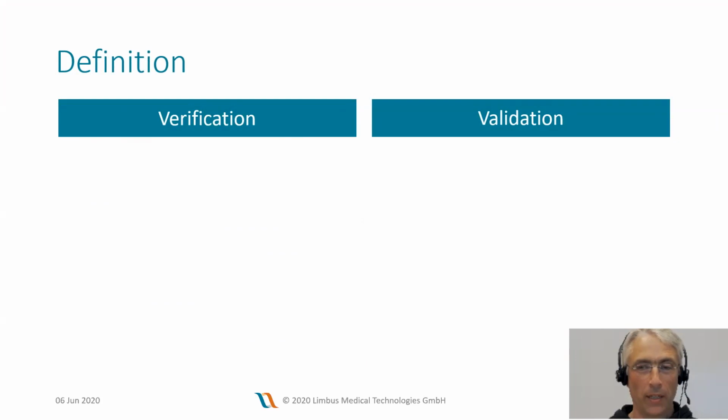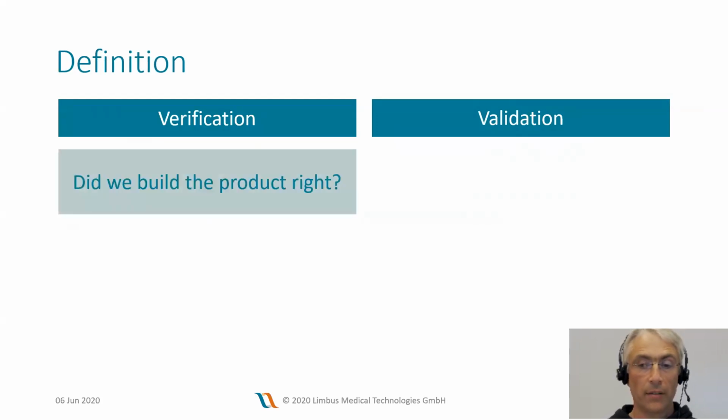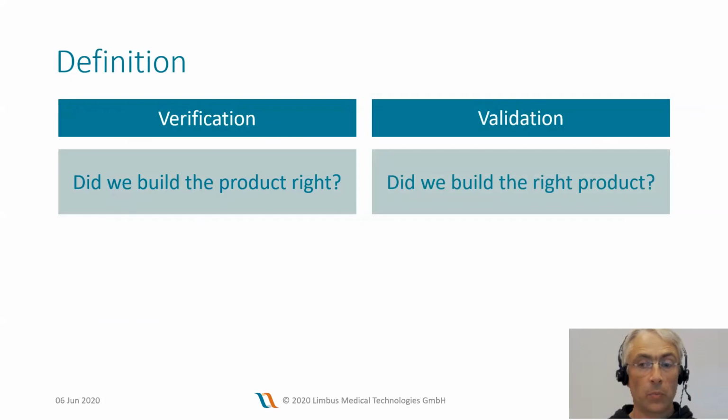I'd like to quickly revisit a few definitions to ensure that we have a common understanding of what validation is. The terms verification and validation are often used interchangeably, or at least in a confusing manner. They are, however, the answer to quite different questions. Did we build the product right? Or did we build the right product? You may also insert your assay or diagnostic test in these questions.